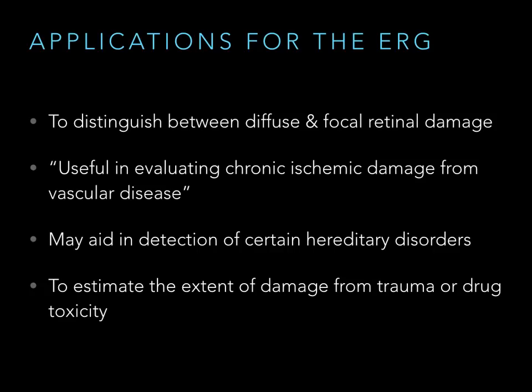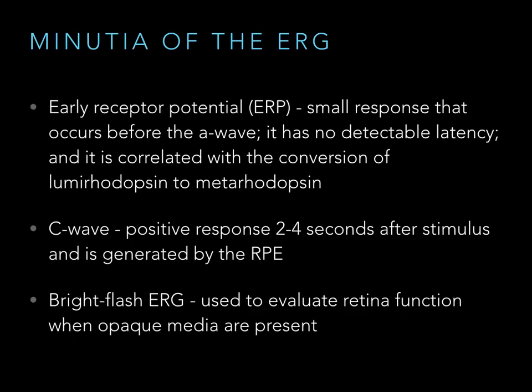On the next slide I'll talk about the trauma, but from drug toxicity, let's say you had a foreign body in the eye, want to know if it's causing siderosis, you could do serial ERGs. Not something we commonly do because we always take the foreign body out, but let's say there's a foreign body embedded somewhere that's hard to get out, we want to kind of wait. That would be one option.